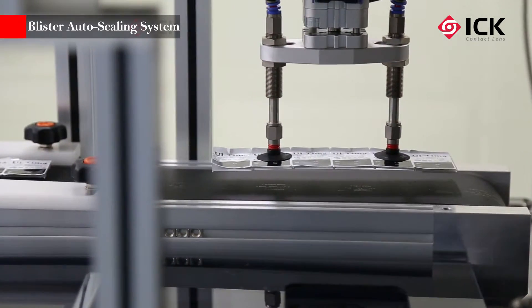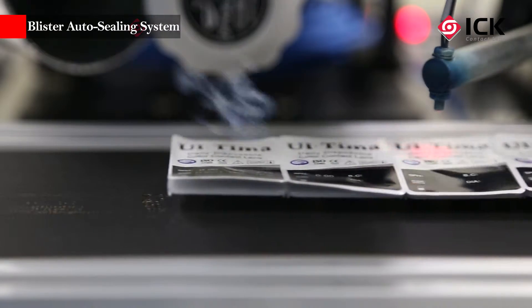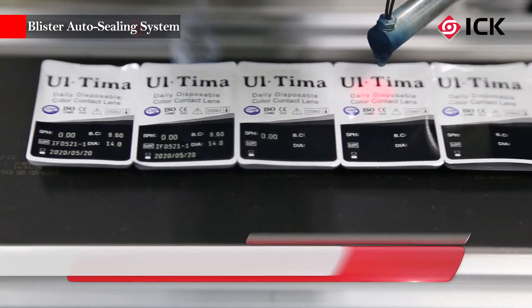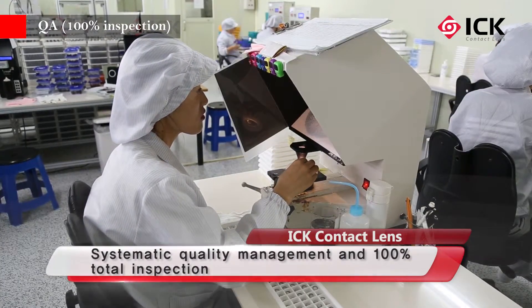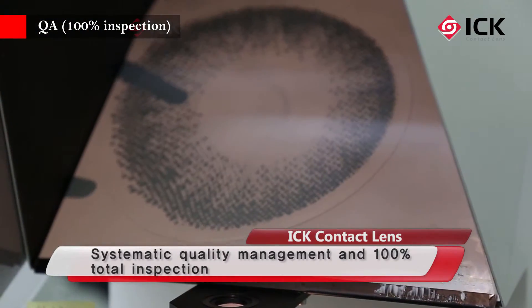Color contact lenses using the mold casting method are thin and ensure vision correction effect, providing both beautiful eyes and clear vision. ICK contact lenses create a beautiful world by striving to achieve zero customer complaints through systematic quality management and 100% total inspection.